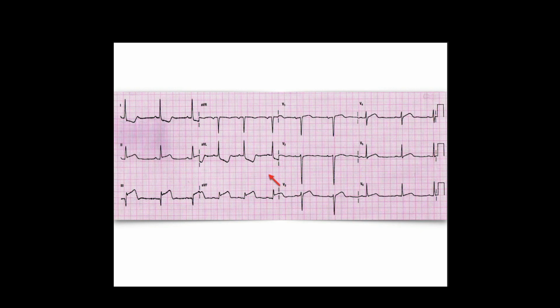So for example, here, Chris, why the ST depression in 1 and AVL, why is it there on this particular 12 lead? Should be a posterior study, right? So check again. You've got lots of time, take a moment and scan through the 12 lead itself and see what jumps out at you as not being all that great. So do you see ST elevation?